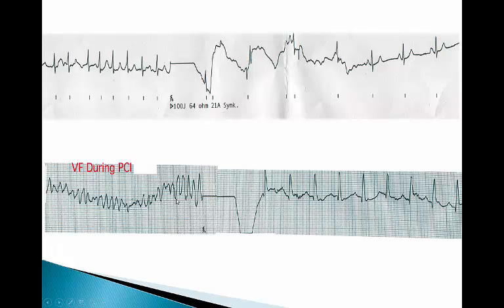So here's just a rhythm strip showing when the patient was cardioverted. This patient was in rapid AFib. Okay, they got shocked, and once they settle down, then they're in a nice sinus rhythm again. Isn't that lovely? It is lovely.